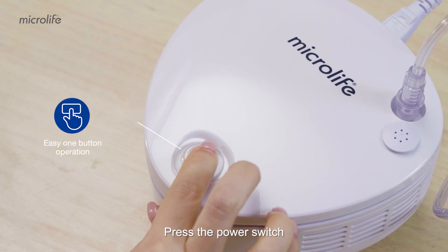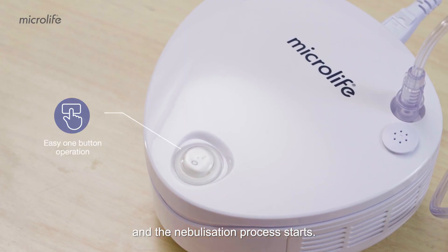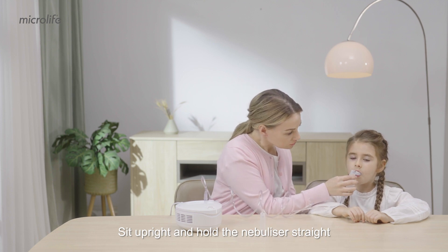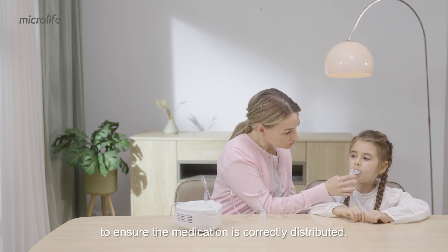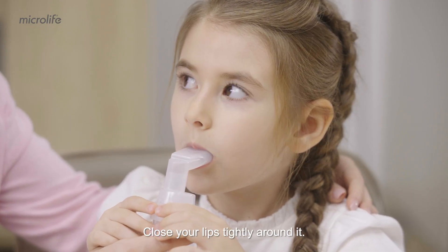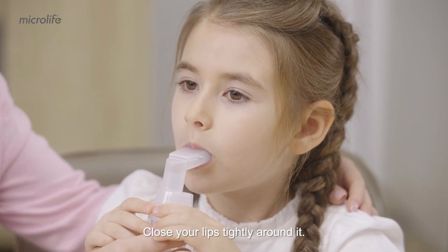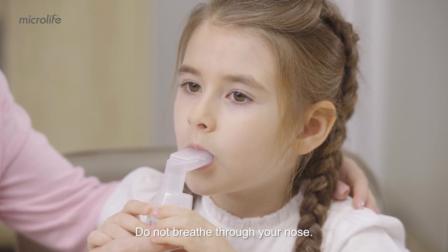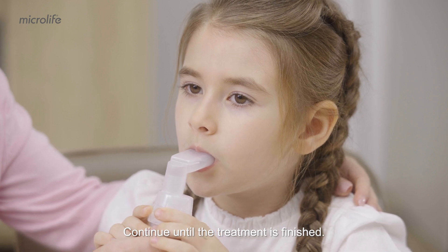Press the power switch and the nebulization process starts. Sit upright and hold the nebulizer straight to ensure the medication is correctly distributed. Put the mouthpiece in your mouth and close your lips tightly around it. Breathe in and out through the mouthpiece normally — do not breathe through your nose. Continue until the treatment is finished.